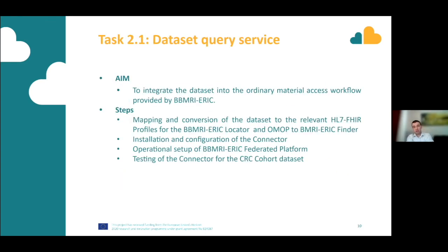The next part was implementation of the dataset query service. This is based on the BBMRI federated platform, which is a next-gen discovery tool within the BBMRI ecosystem that is able to do a federated privacy-preserving querying of sensitive health data.